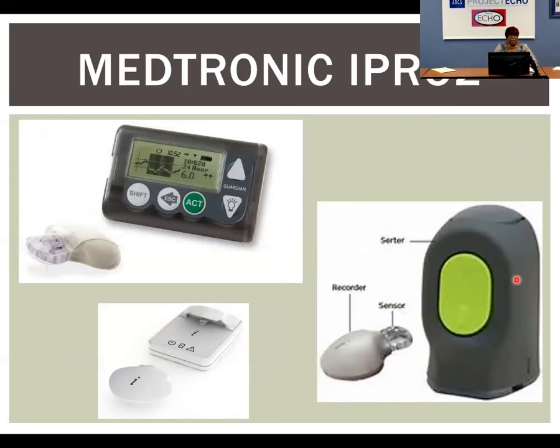And the problems with the Medtronic device and the Dexcom G4 is that even when the patient comes back into the realm of their transmitter or their receiver, it will not retrospectively bring the data back into the device. However, with the newer devices that are coming out, this will no longer be an issue. So if they go away from their receiver for an hour or so, when they come back to within range of the receiver, it will pick up the retrospective data. So I'm kind of looking forward to that one.